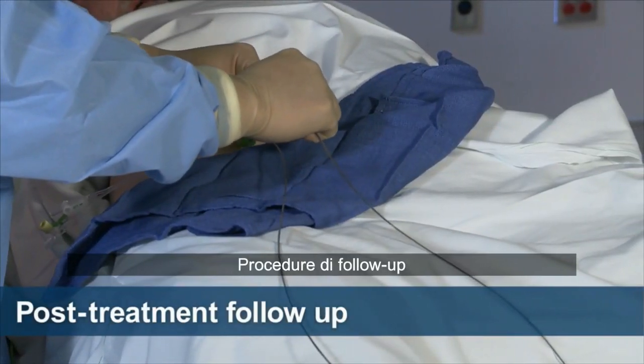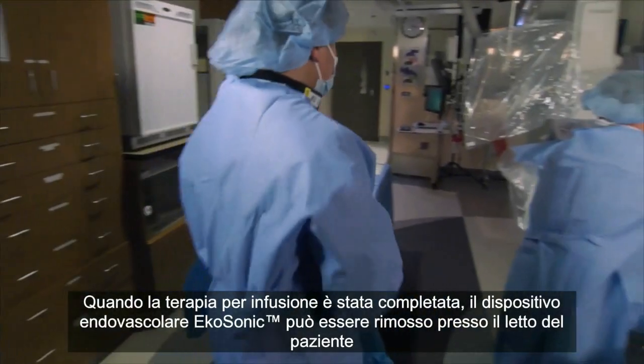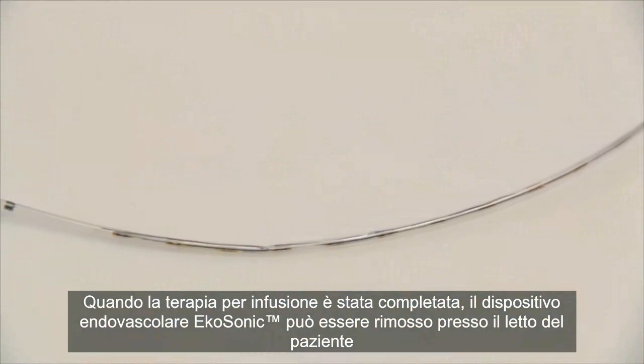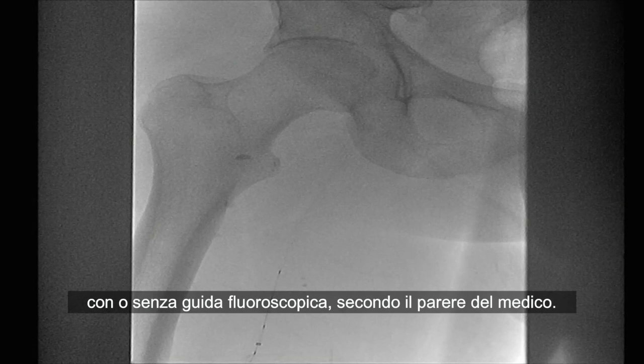Follow-up procedure. When the infusion therapy has been completed, the Ekosonic Endovascular device may be removed at bedside without fluoroscopic guidance, or it may be removed under fluoroscopic guidance according to physician's order.